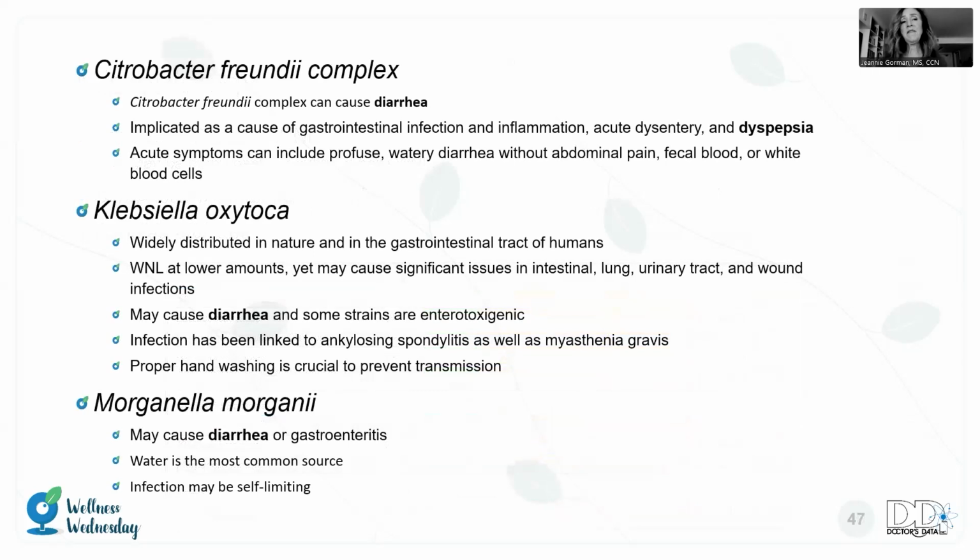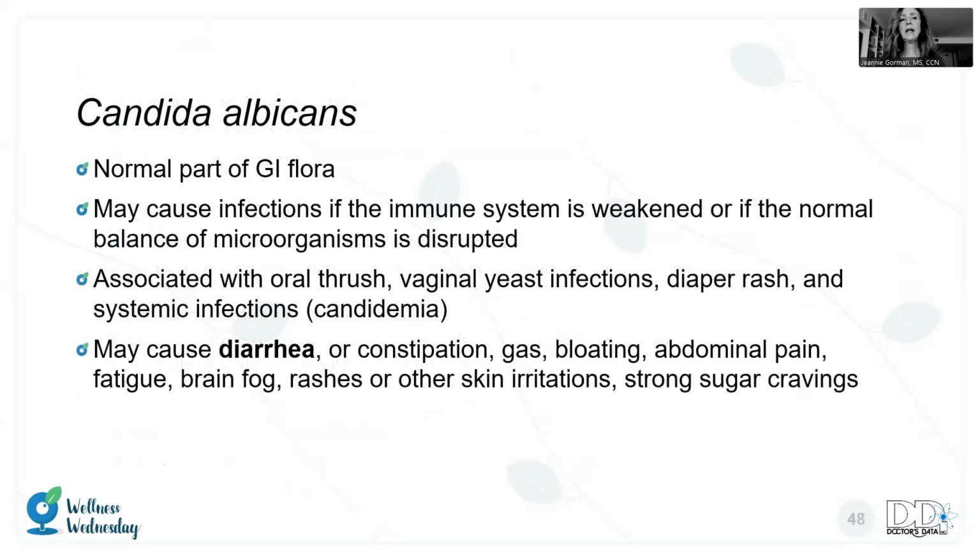Just a brief note about her case. All of these organisms, including the Candida, could be causing the diarrhea. So I'm not sure which one it is, but all of them could cause it. The Candida, as you may know, at lower levels, so at a 1+, is considered a normal inhabitant of the gut. Within a healthy microbiome, you should be able to tolerate and live symbiotically with Candida, according to the literature.